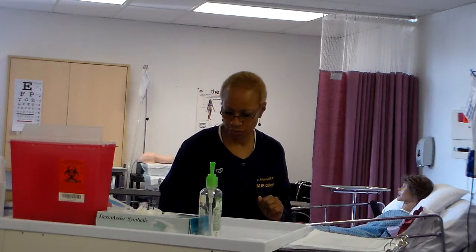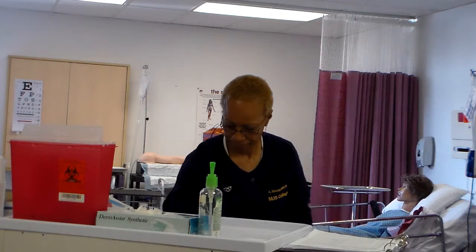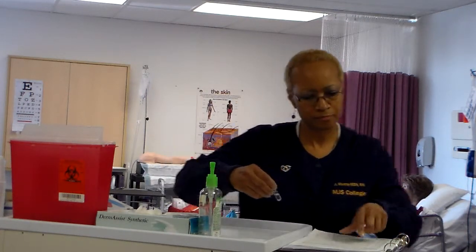Check the date of expiration for the medication vial or ampule. Then you're going to obtain your medication from your drawer. First check: be sure to compare the label of the medication with the MAR while preparing the medication.